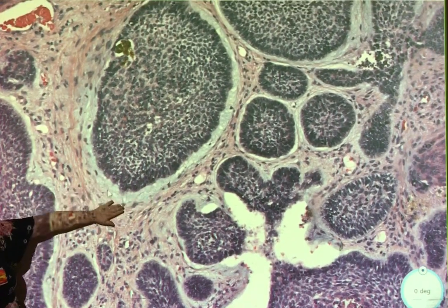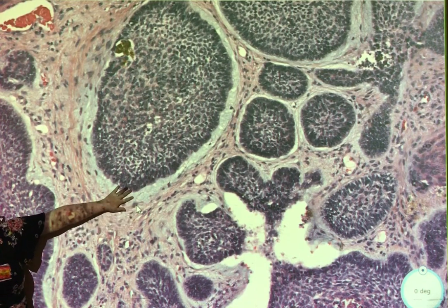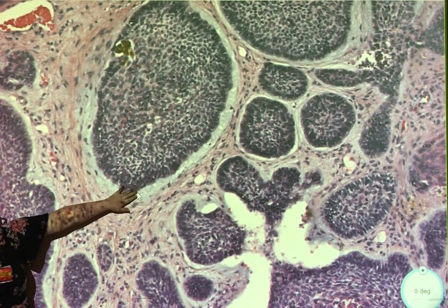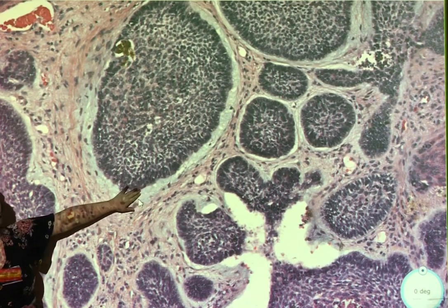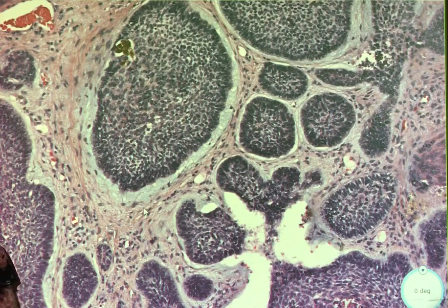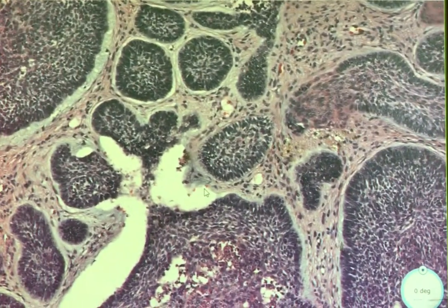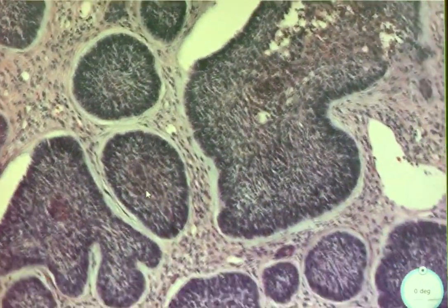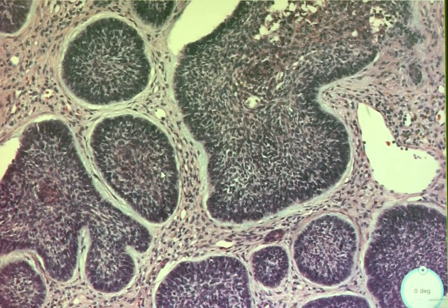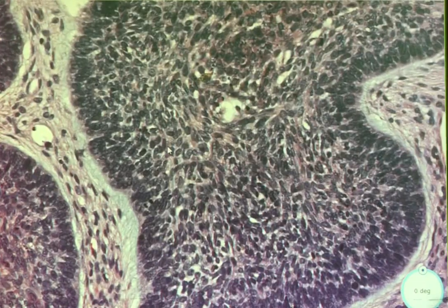Do you see that? How it's like here we have the collagen that's nice and pink, like the stroma. And then this kind of looks more blue. This kind of myxoid. Yeah, myxoid changes. So stromal myxoid changes, but just right around the lesion. And the retraction and the palisading. And it's super blue. It's basal cell carcinoma. Yes. It's like so obvious, from the palisade.